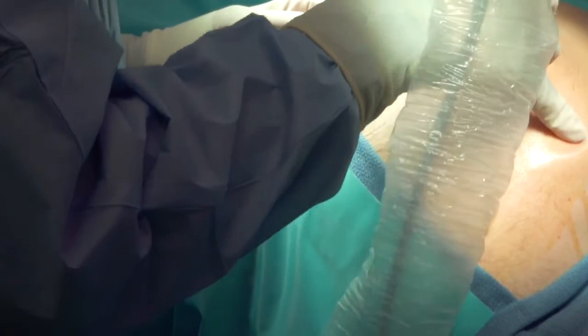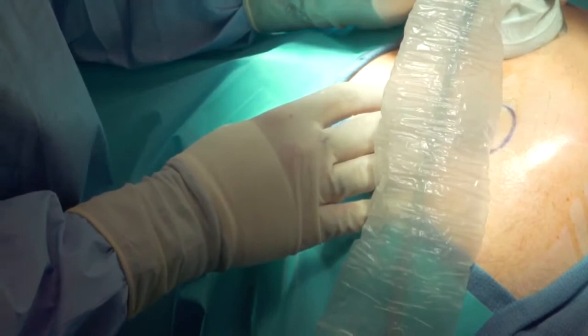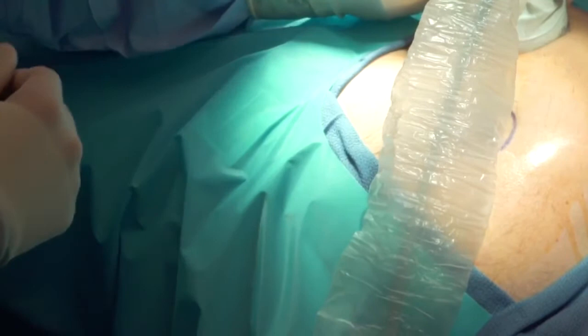I turned the transducer to a more lateral position, and then placed the Doppler, localizing the circumflex artery. Once the artery was localized, which you can see pulsating nicely right there, I basically made a mark about 5 centimeters medial, and we'll get started. So that's going to be my target zone.